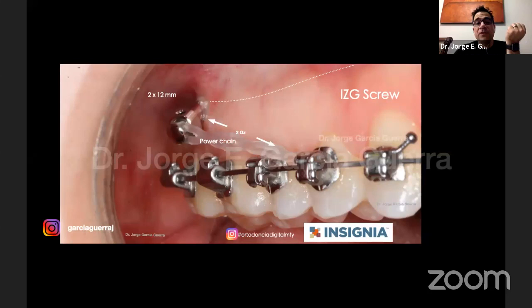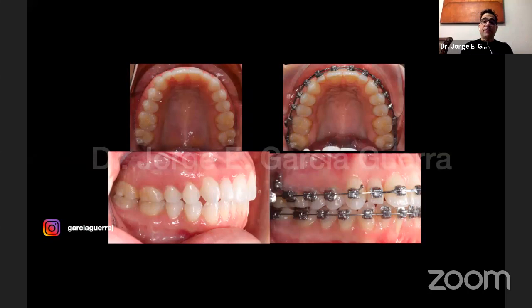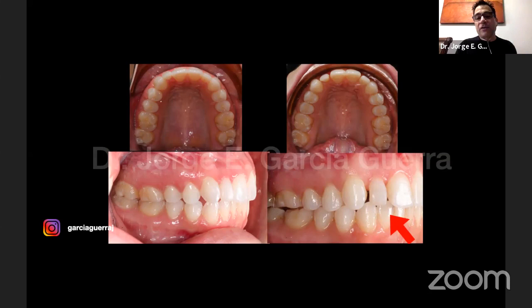Now, in the past lecture, we were talking about smile design, and I was telling you that it's very important to understand that a lot of our patients are going to have very small lateral incisors. In this case, our patient had a prior ortho treatment, so they closed all the spaces and left her in a class 2 canine position. So what we did here was we started to distalize the canines so we can have a class 1 occlusion. We left the space at the end so she can have some veneers placed there, and she had a better result. Now, as you see, they are very simple mechanics. Once we understand the correct size of the teeth, we can put them in a better position.